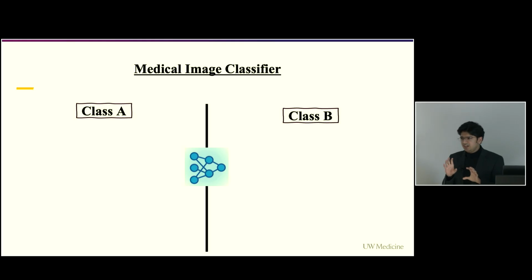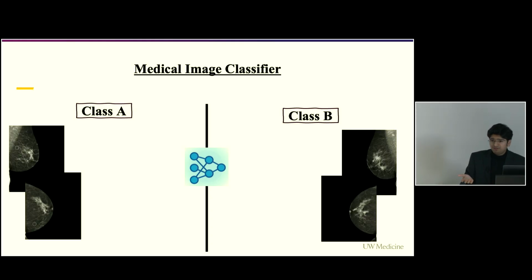Let us say that we have a medical image classifier, a simple binary classifier, which is just taking in images and then putting them into two bags, class A and class B. For example, in the case of mammograms, class A is, let's say, potentially healthy. Class B is abnormal, with, let's say, cancer. It has a disease. For those curious, there's a cancer present here. This is the tumor region in these mammograms.